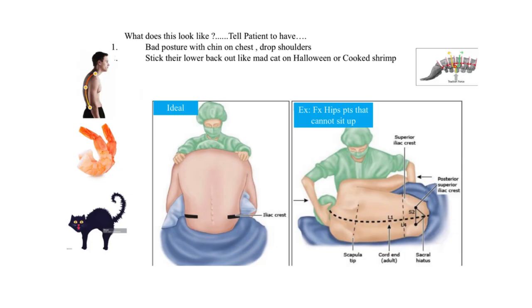Whether the patient wants to be seated or be on their side, you need to know how to position them. An OB nurse is usually on the other side of the bed, facing the patient and helping the patient position. Depending on the facility, there may be a positioner. If not, have a chair for the patient to rest their legs on. Explain everything you do to the patient and provide clear instructions. If the patient doesn't speak English, utilize an interpreter and wait until the interpretation is completed before you do anything.